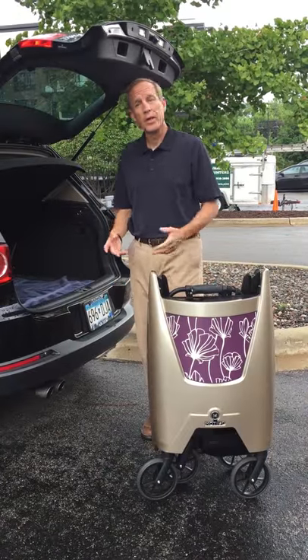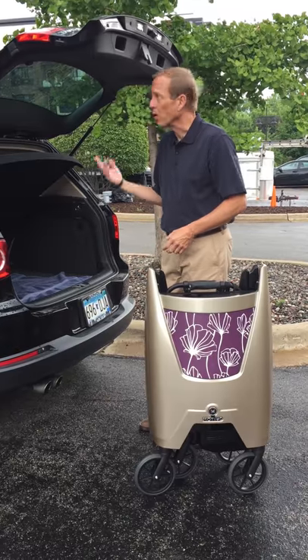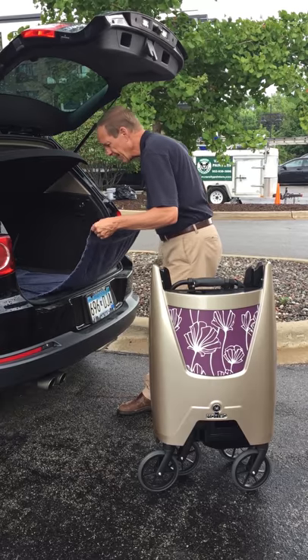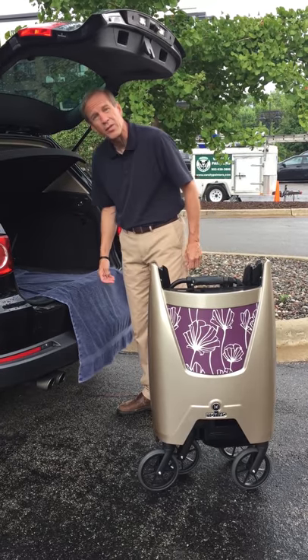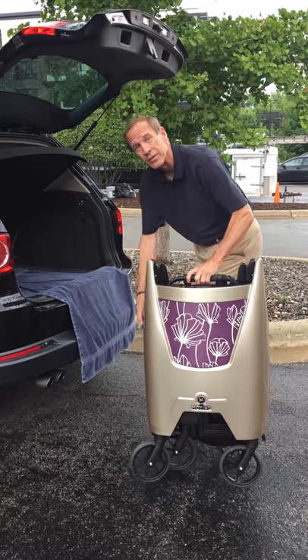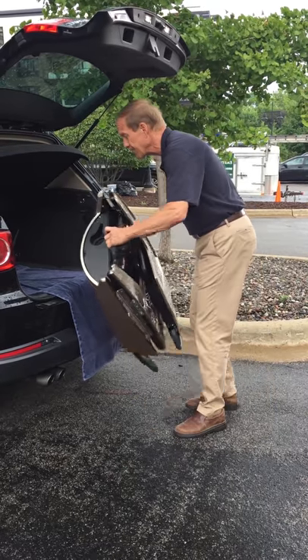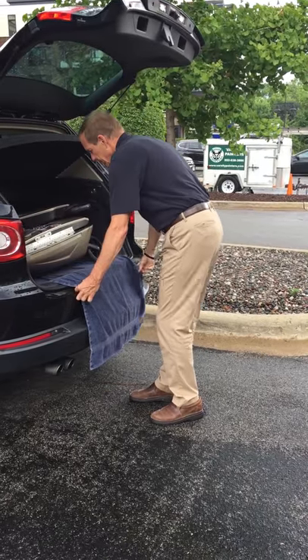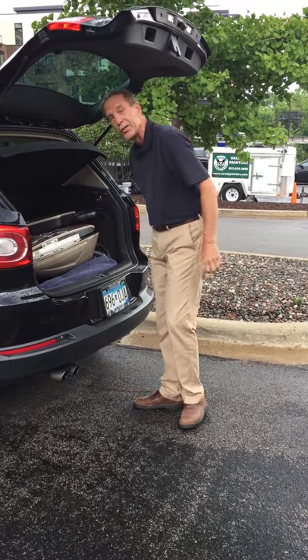When I transport the Tour into the trunk of my car, or a small SUV, I like to use a blanket or a towel. I leave it in there, and then I fold the bottom half just over the bumper so I don't get my slacks or pants dirty. Then, when I have the Tour, I simply lean it up against that and slide it right in. Good to go.